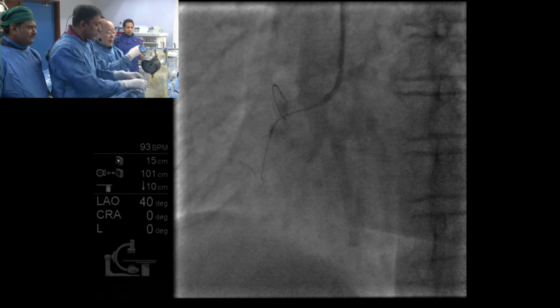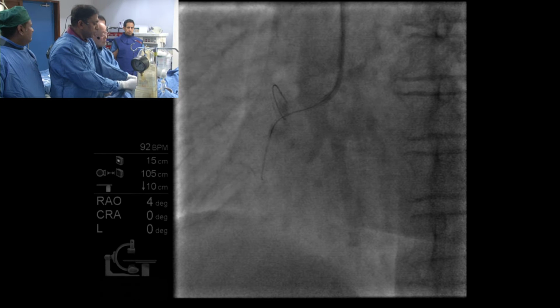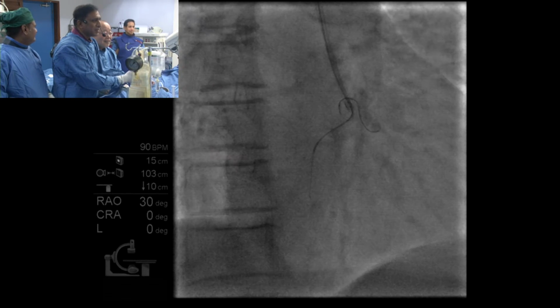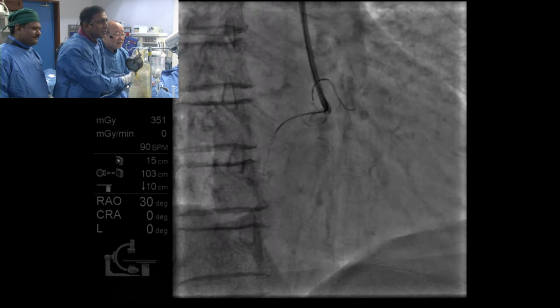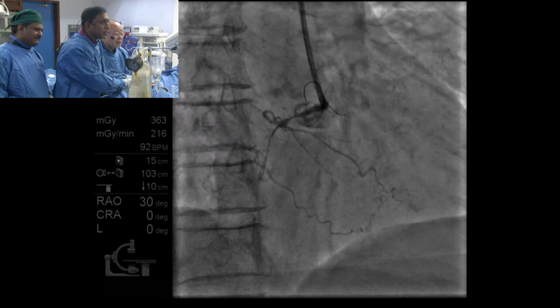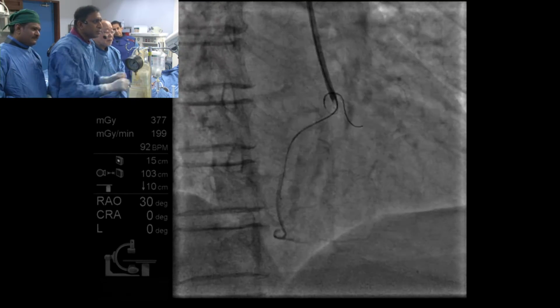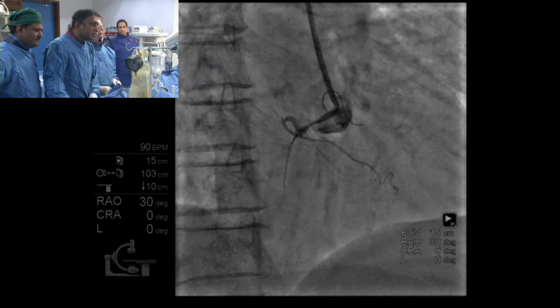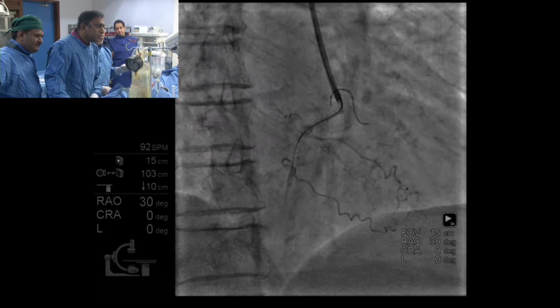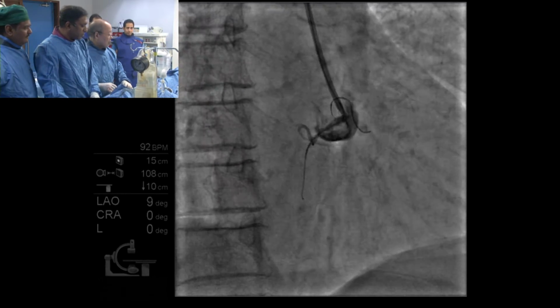Okay, two channels, RAO. Yeah. It looks good. No, I don't think so. It's maybe outside. Okay, I will place this wire deeply.